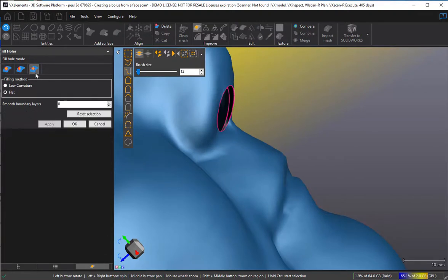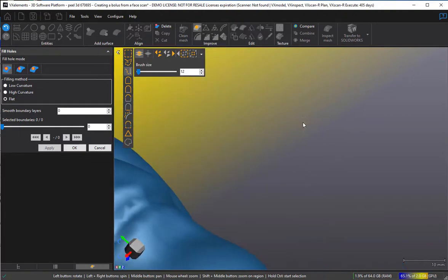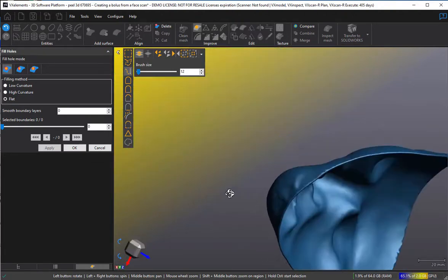I go into my bridge — left, right, middle, left, right, middle — then go to complete hole fill at flat curvature for the rest of this hole. And there I've got a breathing hole. You can do the same for the mouth, but I'm not going to do it here.